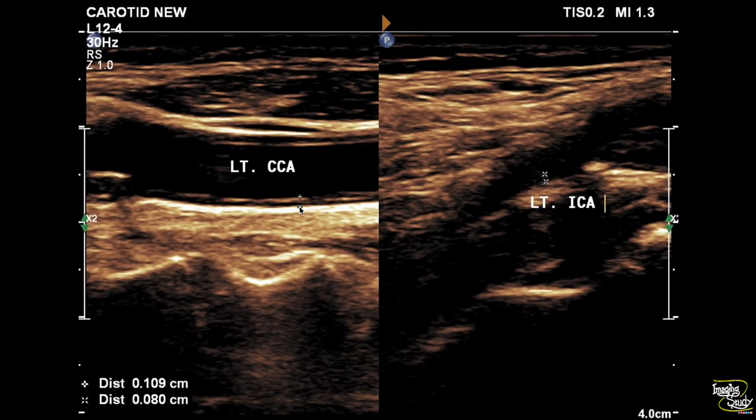Now let's jump to the left side. The left common carotid and internal carotid arteries show increased intima-medial thickness.